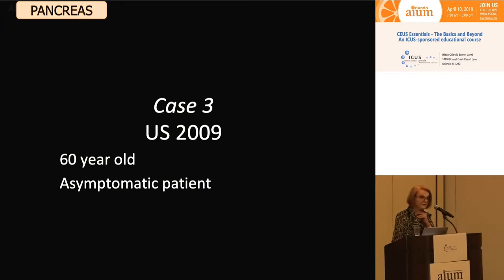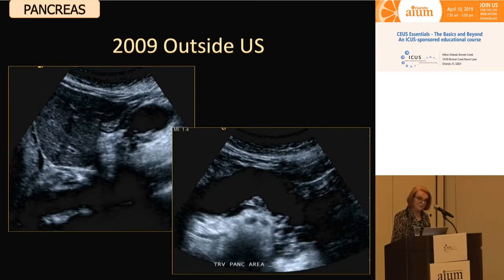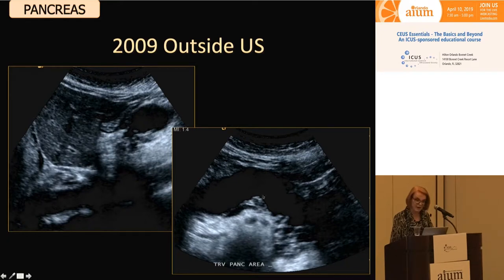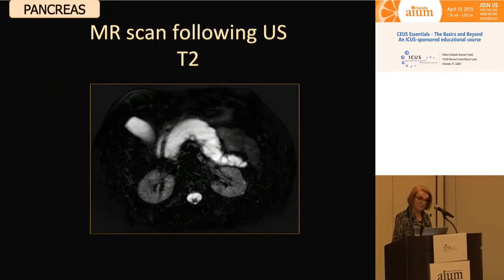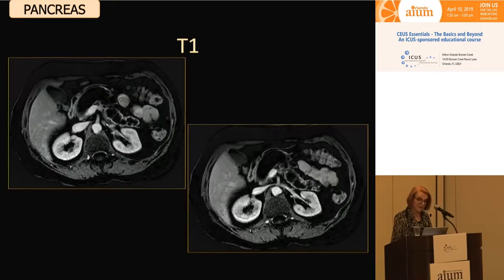This is another really amazing case — a patient with pancreatic pathology. A 60-year-old patient, currently asymptomatic. A 2009 outside ultrasound scan reported a big pancreatic duct. On the long axis and axial view, her pancreas is really made up of this duct, but no comment was made about the solitary papillary growths within the duct. She had an MR scan following the ultrasound: on T2 imaging, virtually her entire pancreas is replaced by a massive dilated pancreatic duct, interpreted as related to a tumor in the pancreatic head.